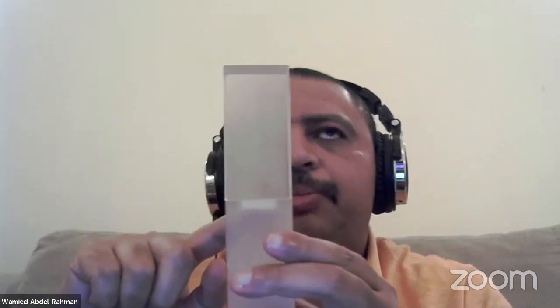The film was positioned at a depth of 9.3 or 9.4, I forgot. Originally, we wanted it to be done at 10 centimeters. That's what everyone uses, but the machinist who shaped this got the dimensions wrong, and we said, okay, it's fine. So we did these corrections with Monte Carlo. We knew how to do that.